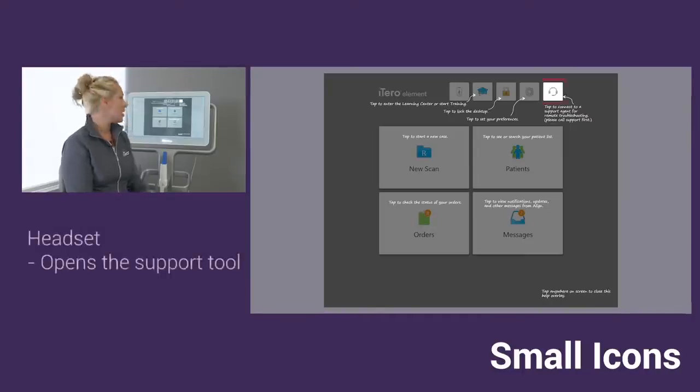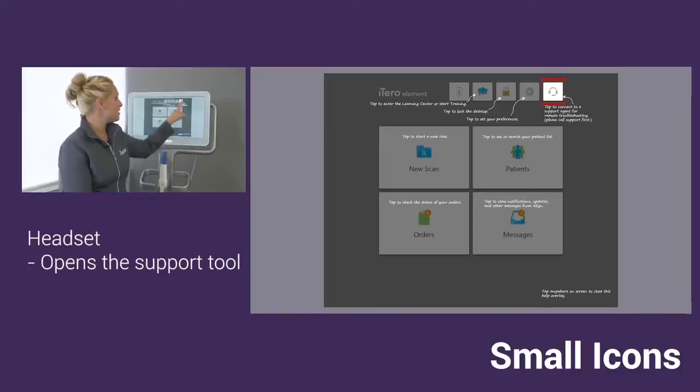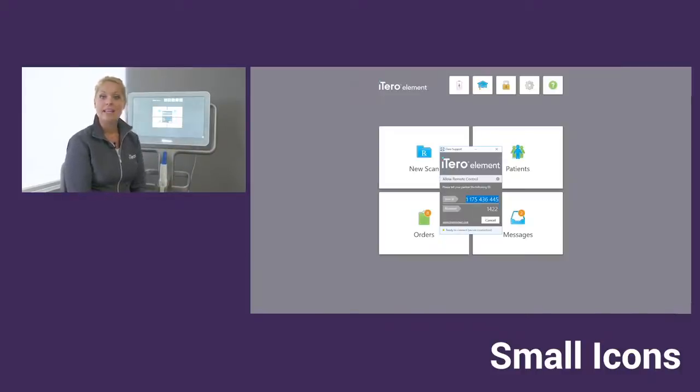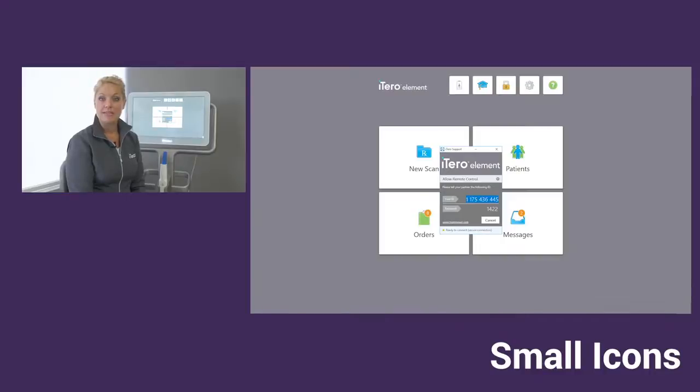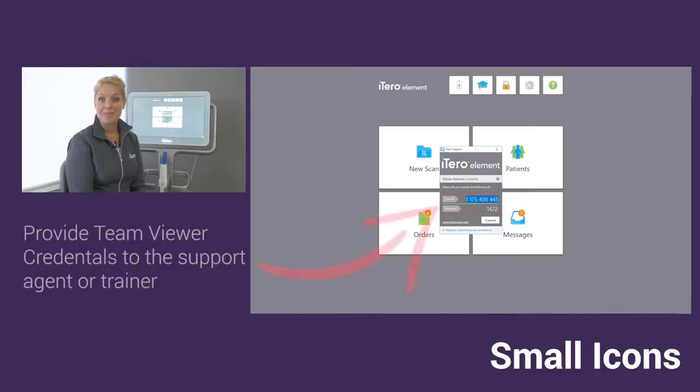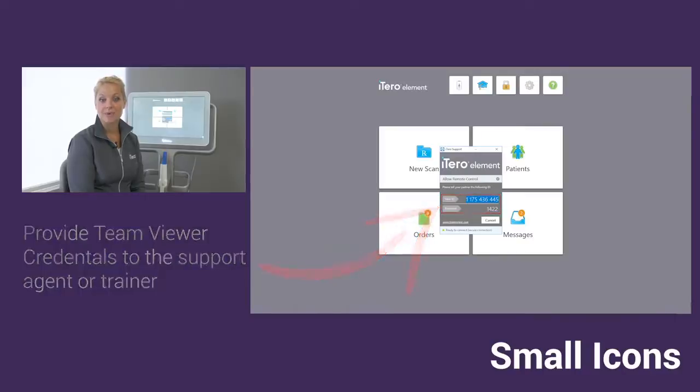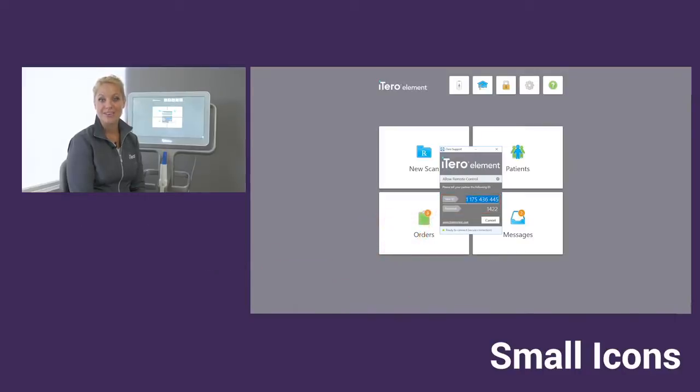You'll notice also that we do have this headset. When you tap on the headset, that will give you the TeamViewer ID number and password that you would provide the Align Technology representative to remote into your scanner.